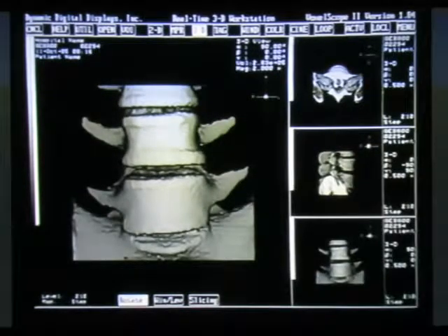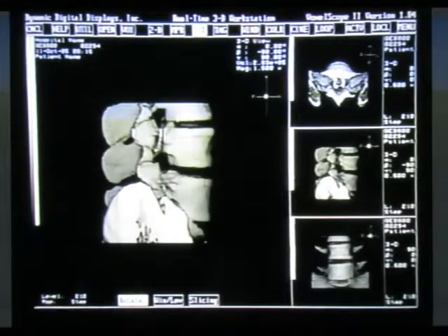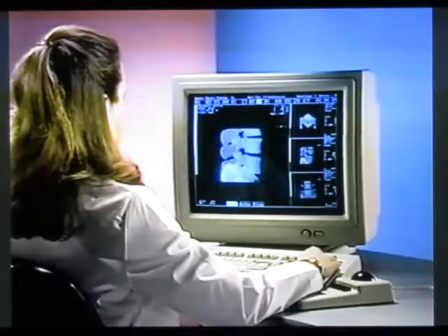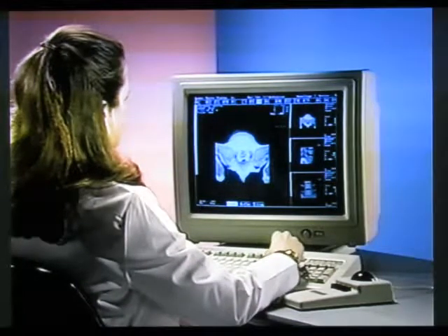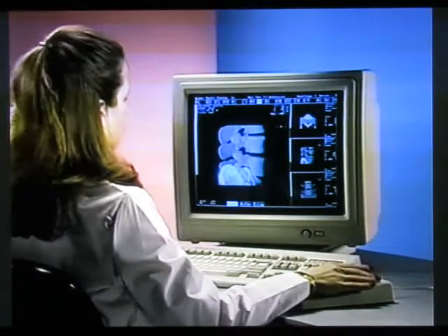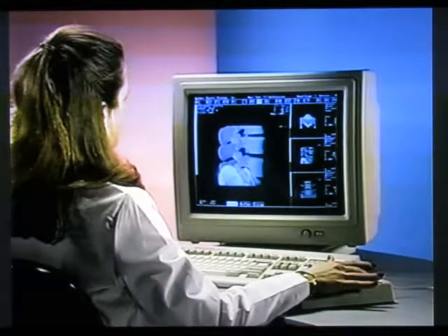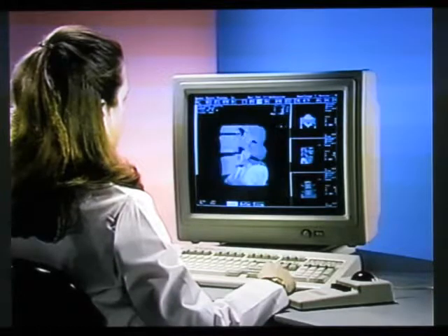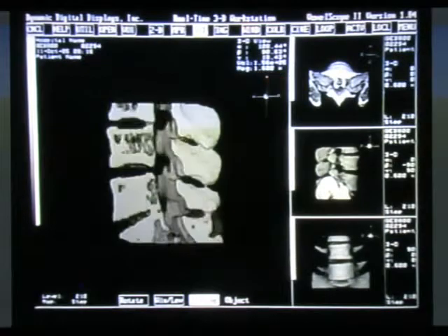Here we can see the osteophyte quite clearly in the lateral view. This image may now be manipulated at will, and additional images can be created with no pre-processing whatsoever. For example, you can easily zoom in on the image, or the 3D image can be displayed in base, AP, or lateral views, rotated by the trackball, or flipped 180 degrees for easier viewing. You can even slice through the imaged object for better visualization of the osteophyte. And of course, any image may be saved for future reference or transferred to hard copy.